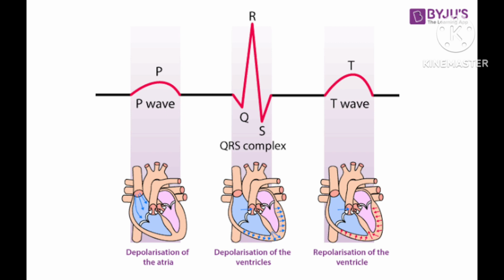Now, in an ECG, which means electrocardiography, a sensitive lever will be there. In an ECG, a sensitive lever traces the change in current on a moving sheet of paper.